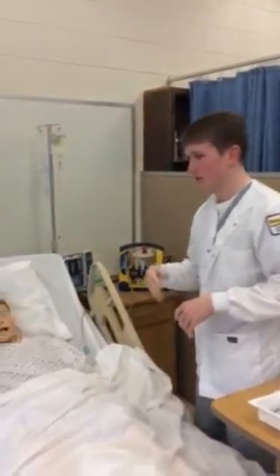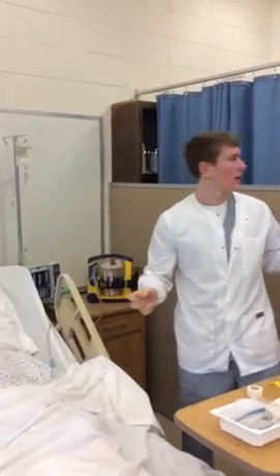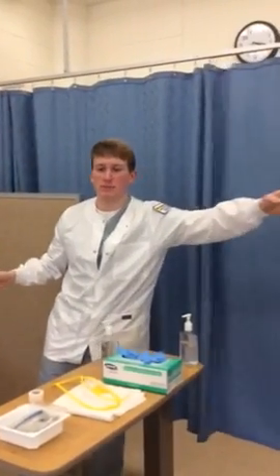Then I'm going to identify the patient with the two patient identifiers, so have them tell me their name and birth date, then check their name band, make sure it matches, and compare with the MAR too, and then provide privacy by bringing the curtain around.